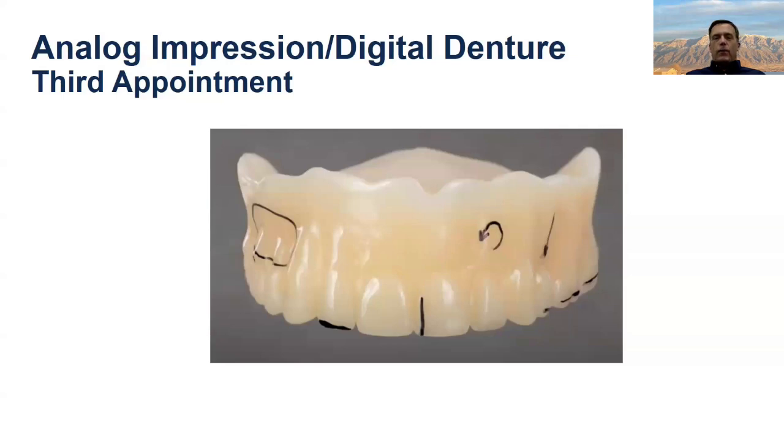let them try it out basically, so you can get a little additional feedback. You can pretty much do whatever you want with this. If you want to mark on it, as you see in this image, feel free. If you need to shorten something, you can shorten it. If you want to add a little bit, you could add some composite if you wanted to.